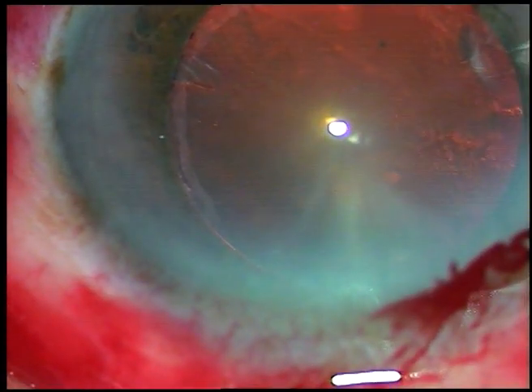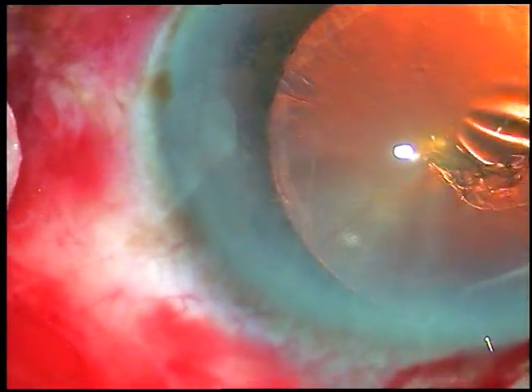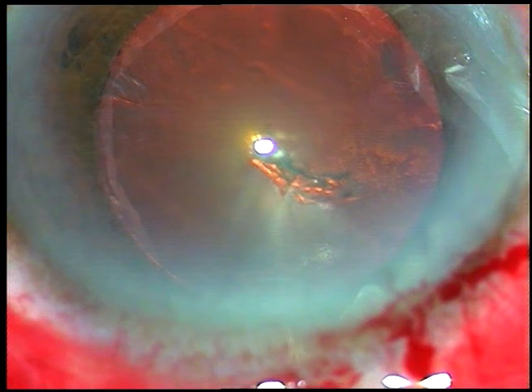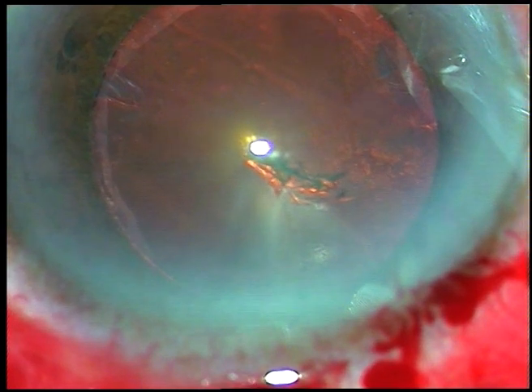Now capsulorhexis is to be done. A 26-gauge bent needle is used to raise a capsular flap. I hold this flap with a utrata forceps. I make this flap quite big so that I can hold the flap very easily with the utrata forceps.